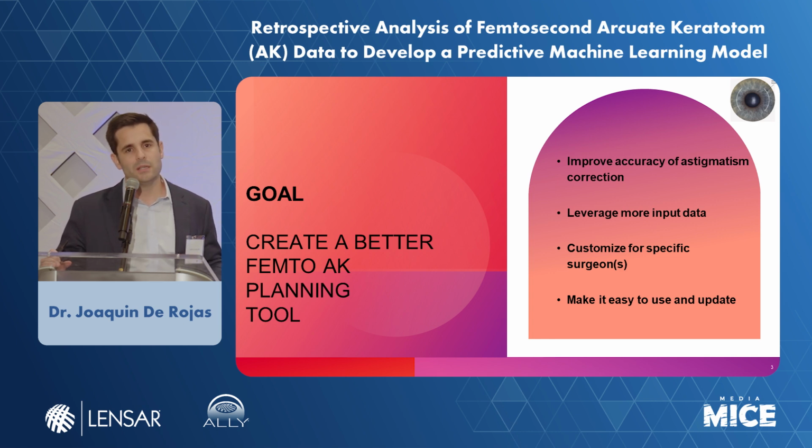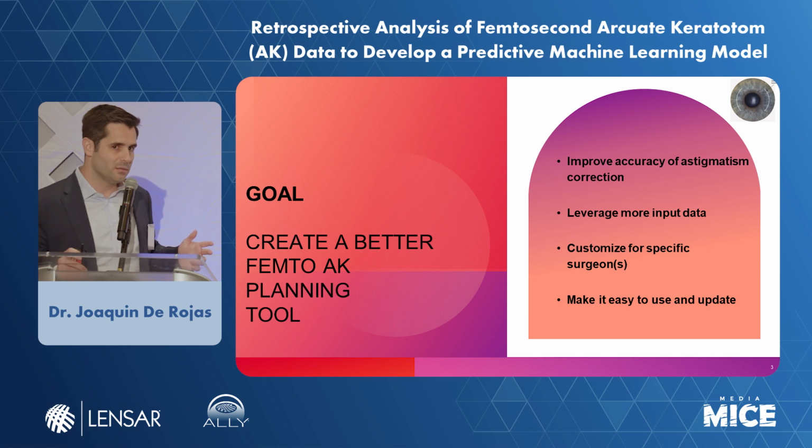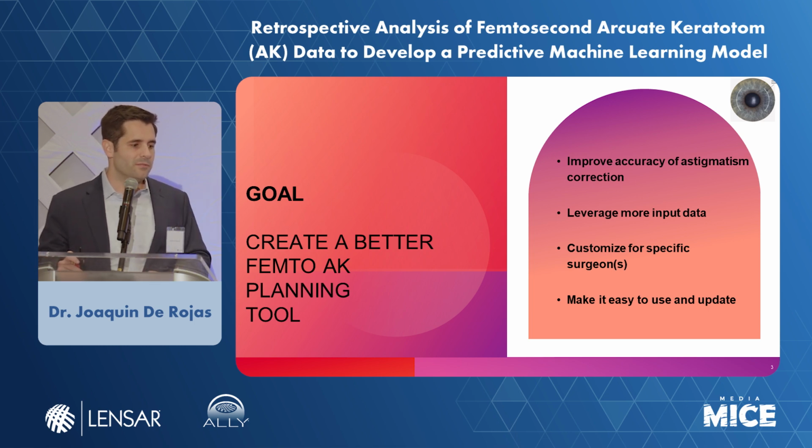Or maybe just having different machines. What is the interaction between the Cassini and the IOLMaster? These are all things that could potentially be a factor. And that's what machine learning is really good at. We may not understand all of the interactions at play, but these algorithms are very good at understanding the complex interplay that may not be captured in a regression analysis. So the other goal is also to have a system that you can update and you can customize.